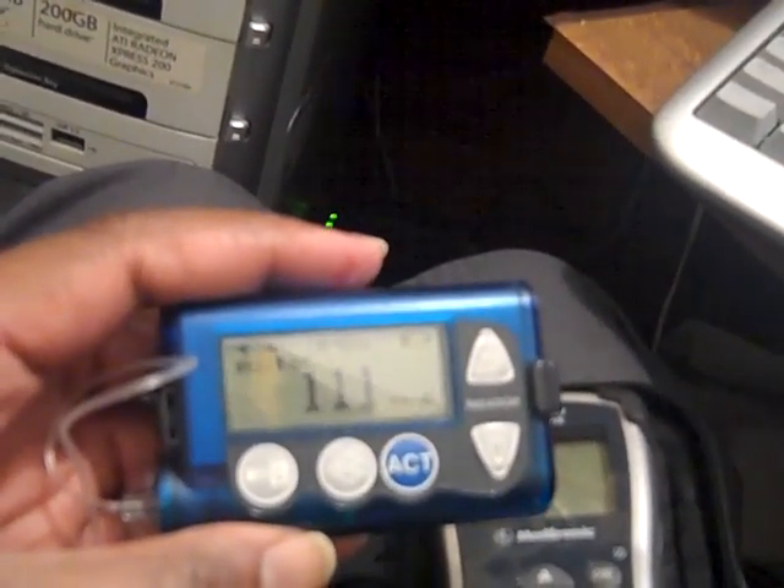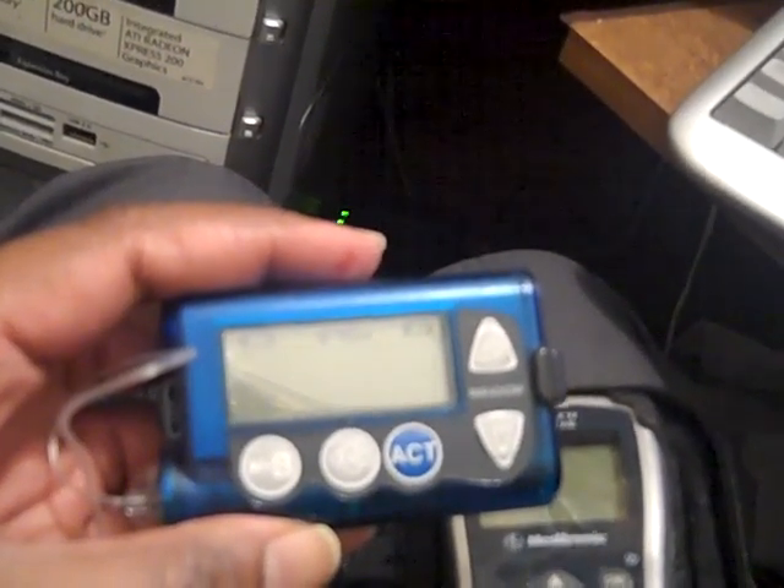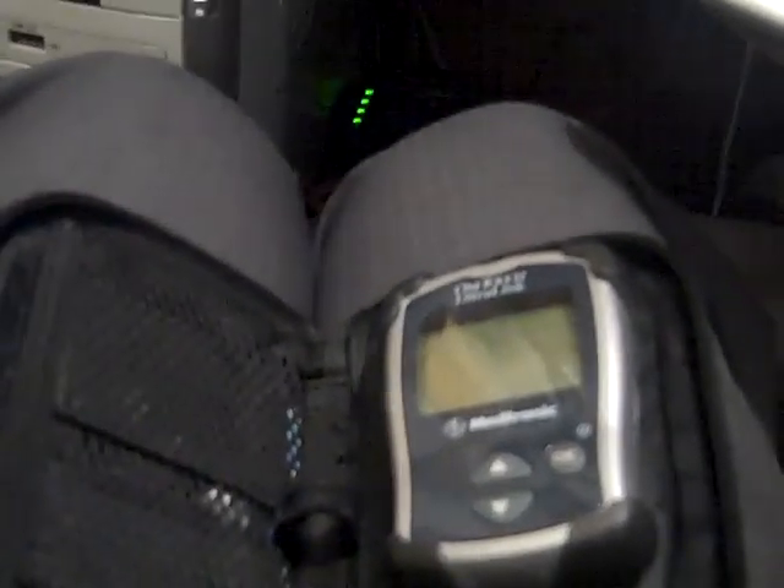If you were to buy it directly, it would cost $6,000 — very expensive. But it beats taking four or five injections a day, sometimes six. So I love it. That's good.